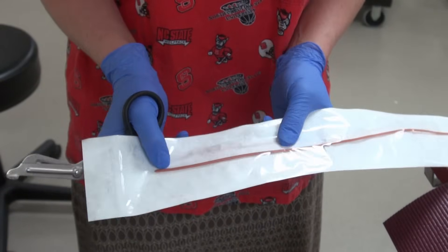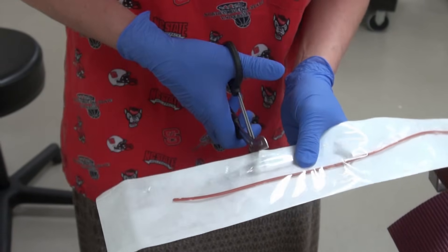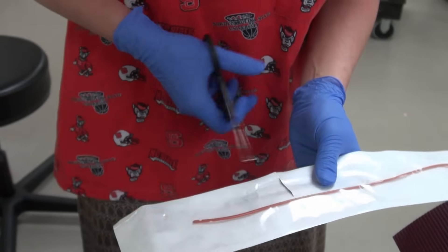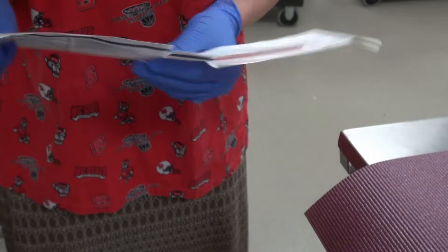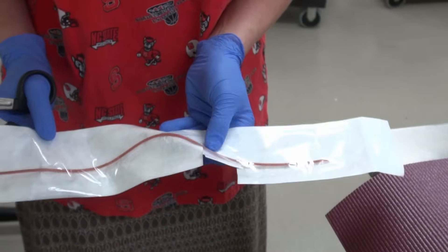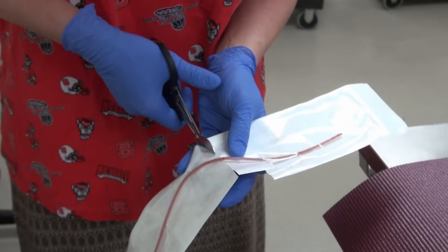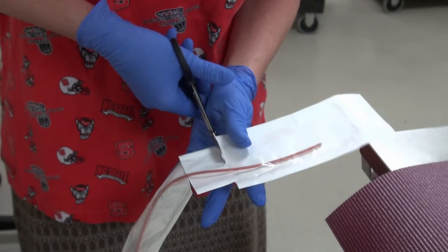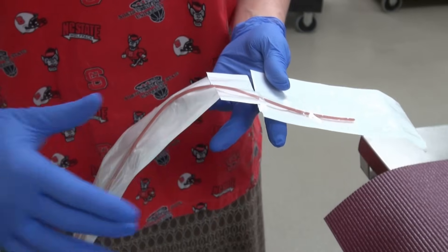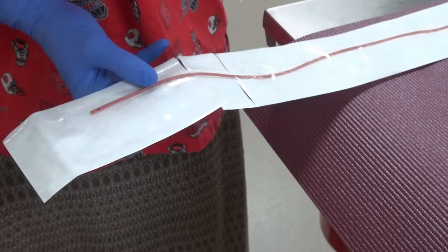Now we are ready to prepare the catheter. The technique Andrea will use here involves cutting a movable piece from the sterile outer wrap that will allow her to handle and advance the catheter without touching it and without the need for sterile gloves. She is removing the distal few inches of the wrap to expose the catheter tip and then creates a movable piece that is a couple of inches wide.